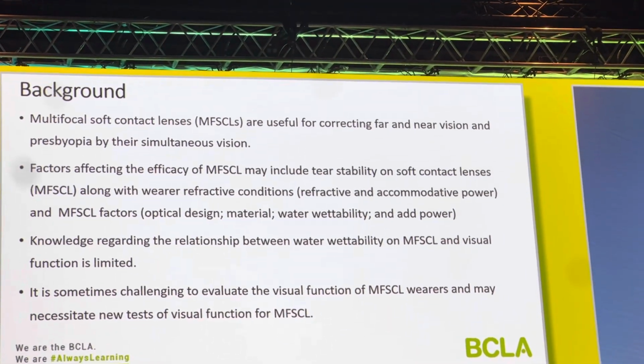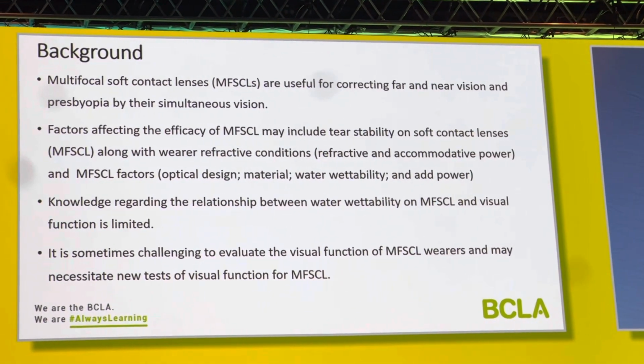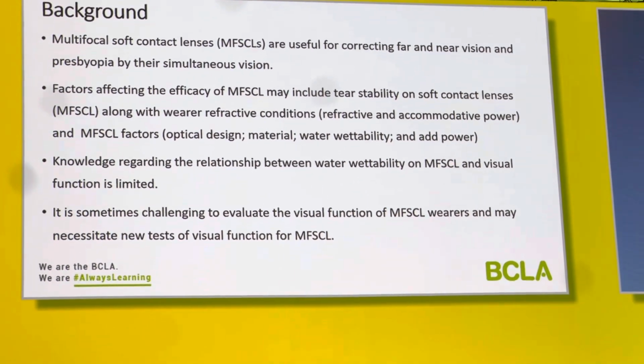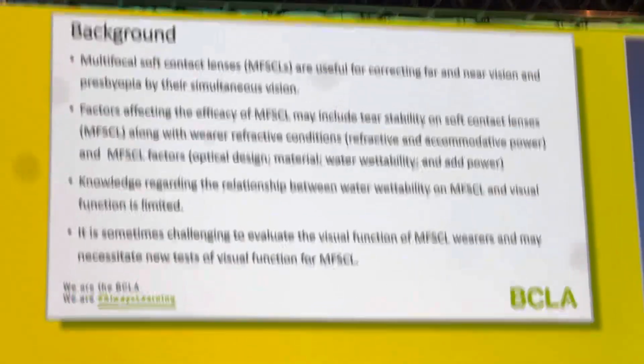Background: multifocal soft contact lenses (MFSCLs) are useful for correcting both far and near vision, and presbyopia, by their simultaneous vision.